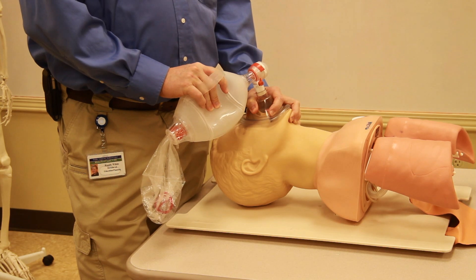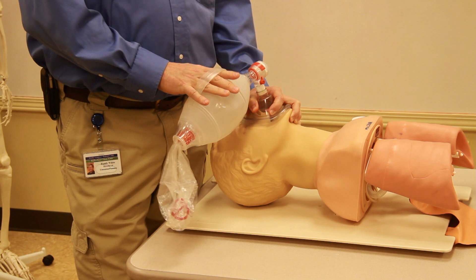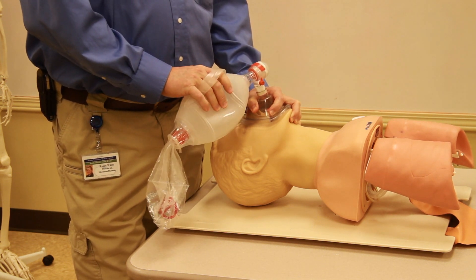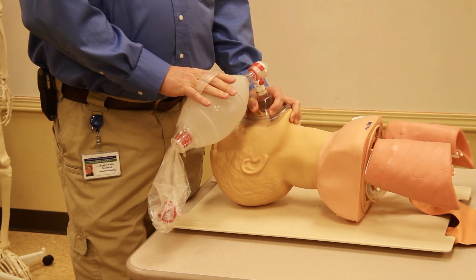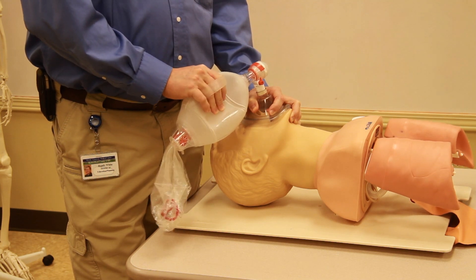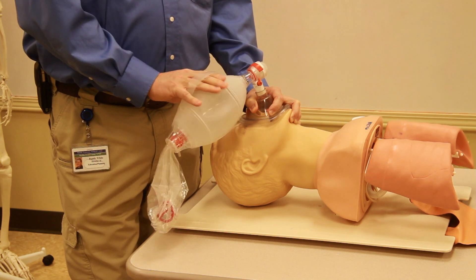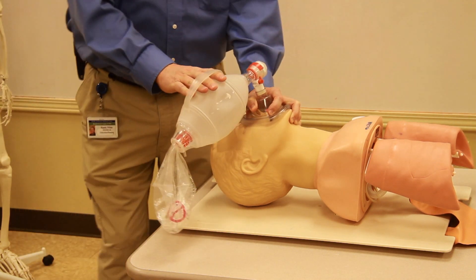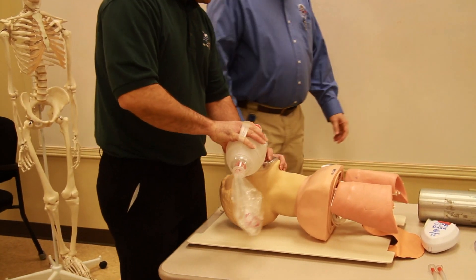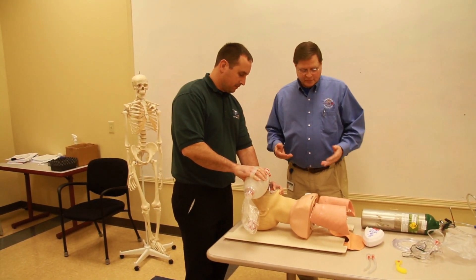With any advanced airway, we want to block off the esophagus so that vomit can't travel up into the lungs. We want to protect the airway so we ventilate only the lungs, not the stomach. I'll ask my assistant to come in and ventilate once every five seconds.